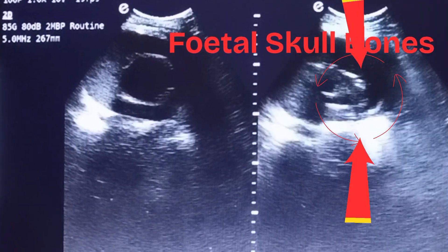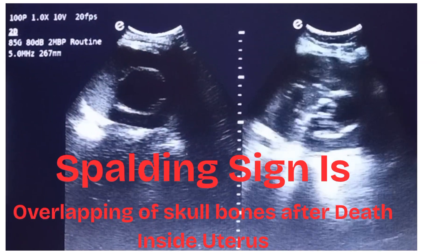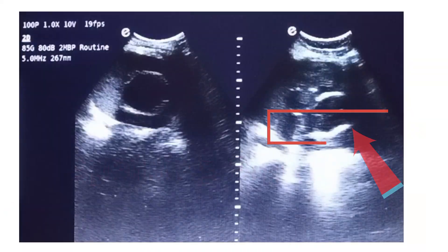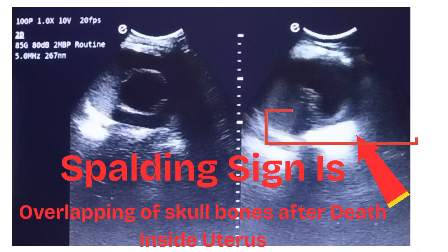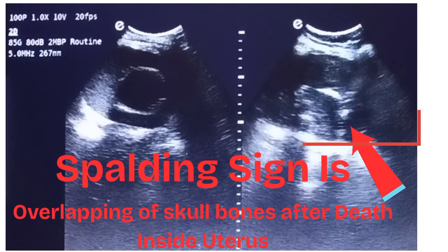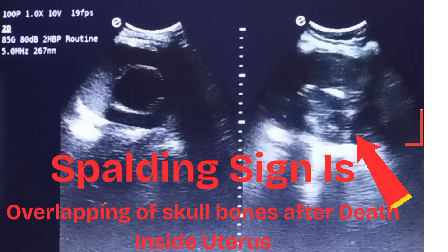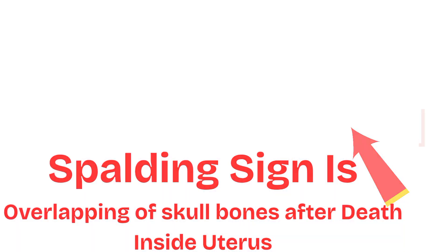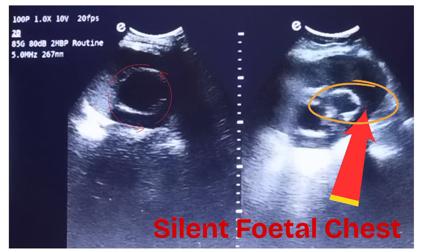A very early sign of intrauterine fetal death is Spalding's sign. Spalding's sign is the overlapping of skull bones after intrauterine fetal death. Here you can also see the silent fetal chest.